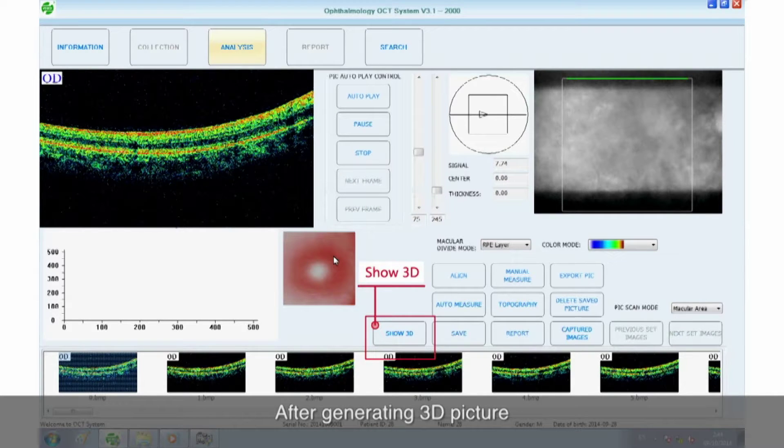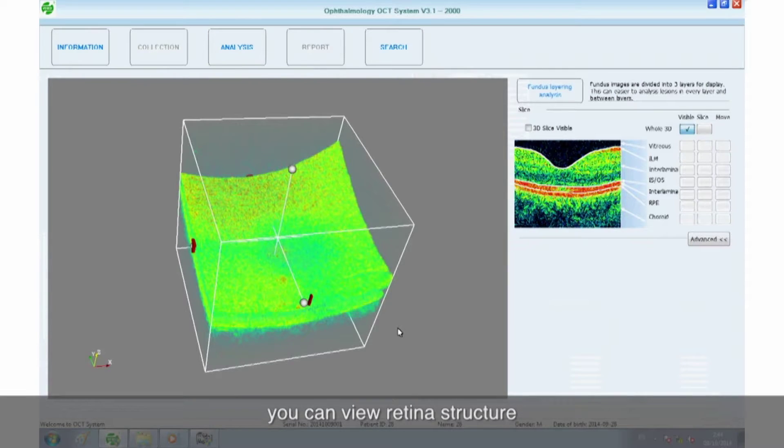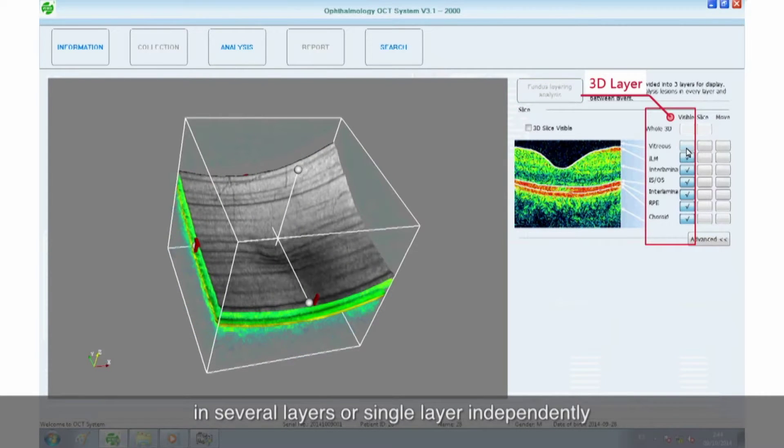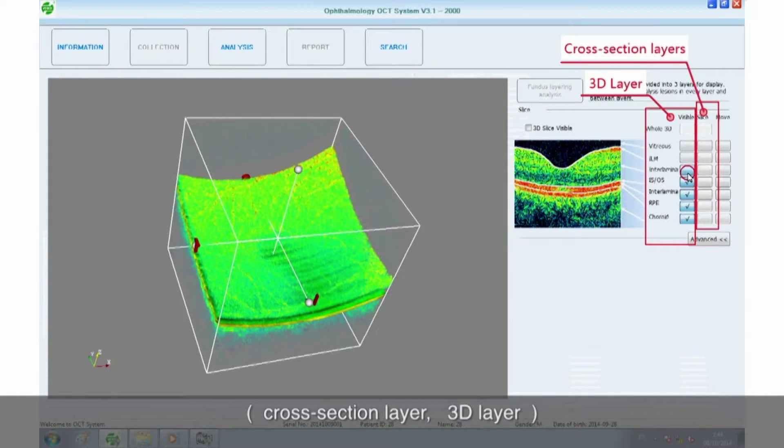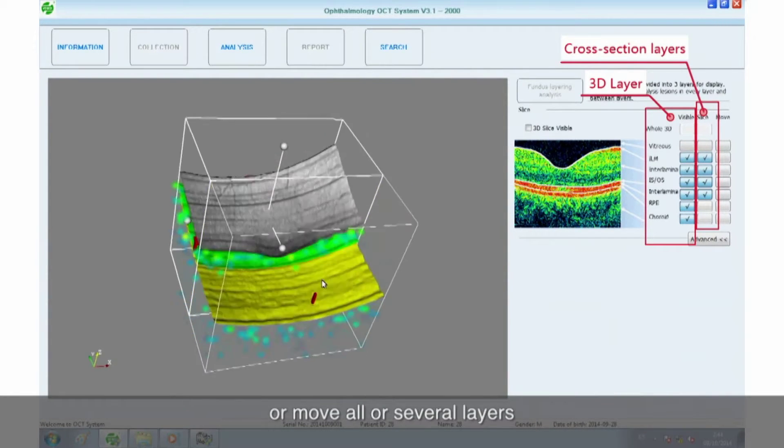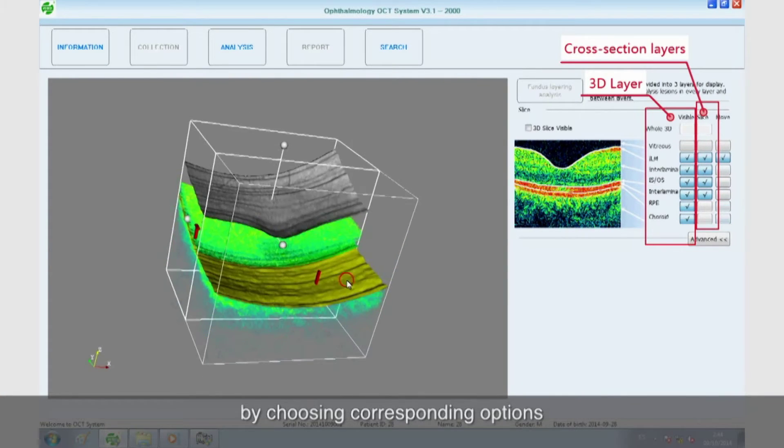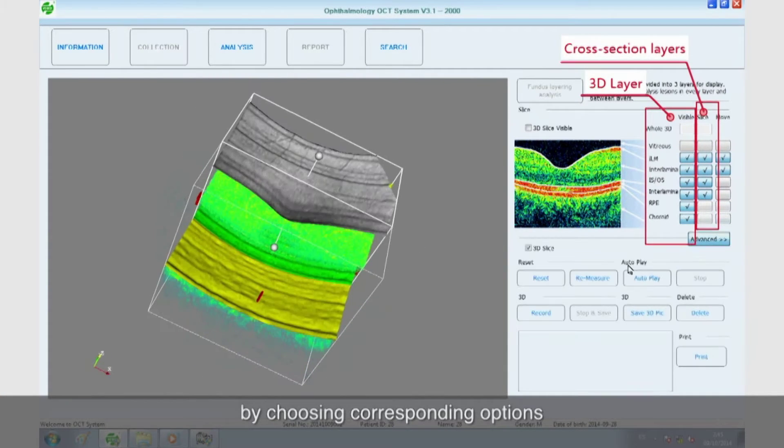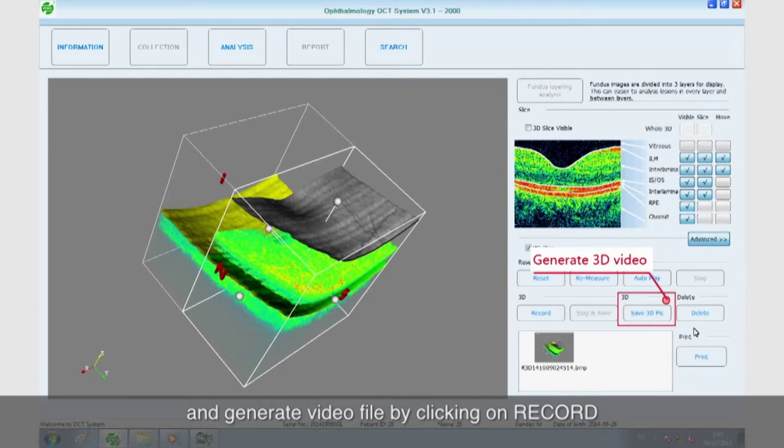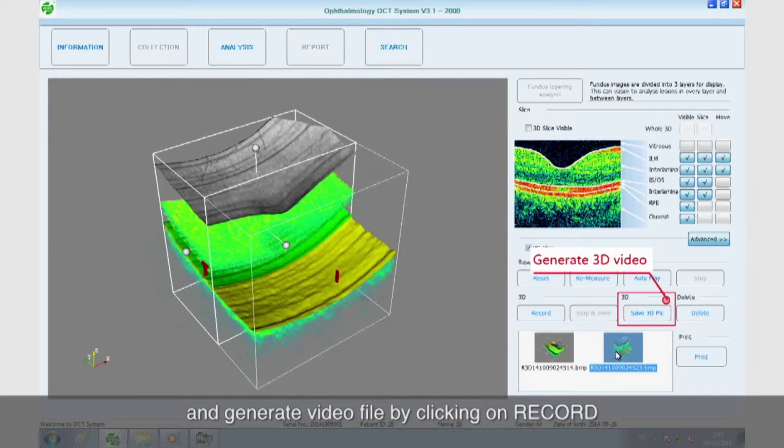After generating 3D picture, you can view retina structure in several layers or single layer independently: cross-section layer, 3D layer. You can also slice up or move all or several layers by choosing corresponding options. In addition, it can save 3D picture and generate video file by clicking on record.